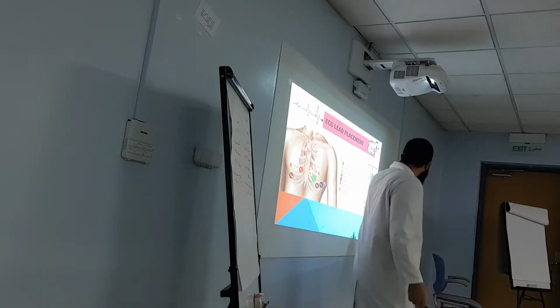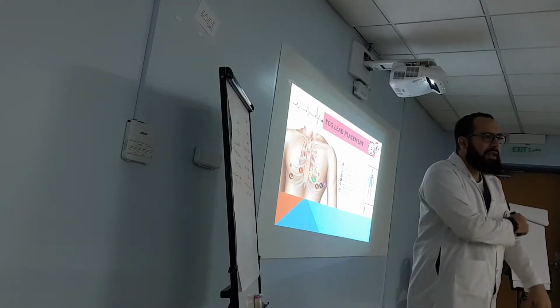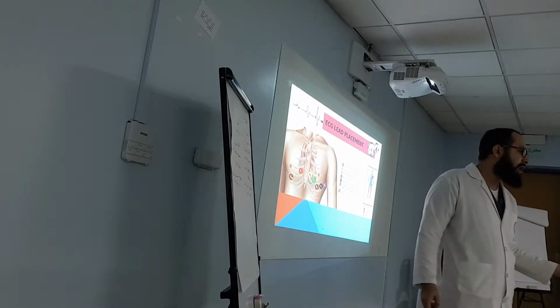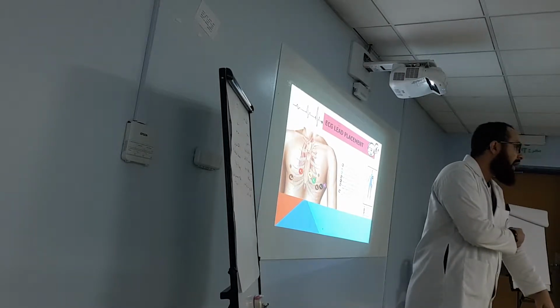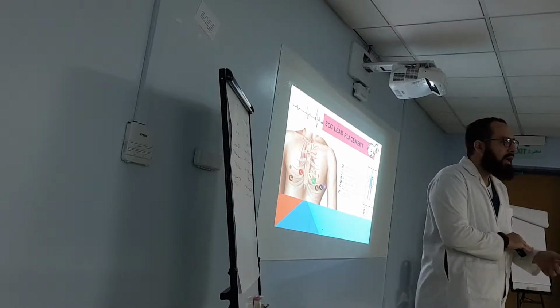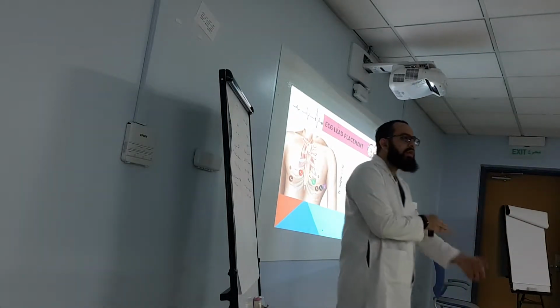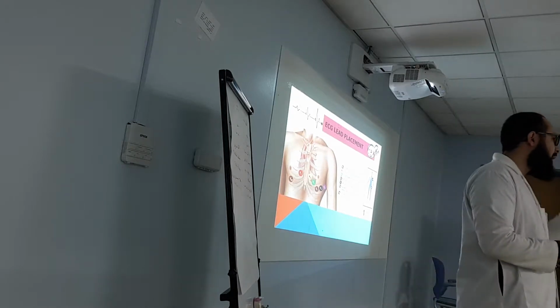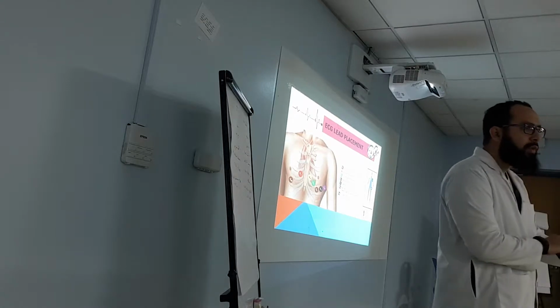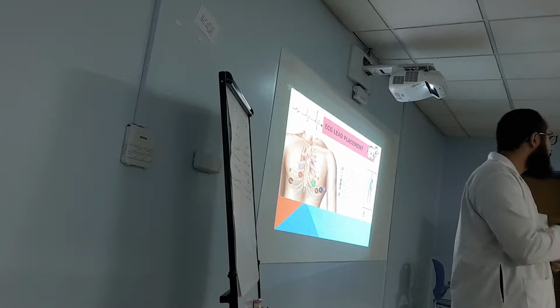What about the limb leads? Put the limb leads anywhere on the limb, but put them in equal positions. Sometimes the patient has an amputation. If the patient has an amputation, you put it at the limb, preferably not on muscle. Probably you put it here, right? Because if the patient has muscle contraction, it will pick this up. If you put it on the muscle, it will pick it up. So put it on a bony prominence, so there is less activity and it will catch electricity coming purely from the heart.